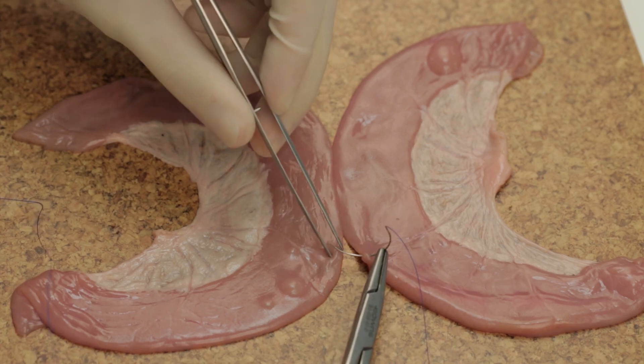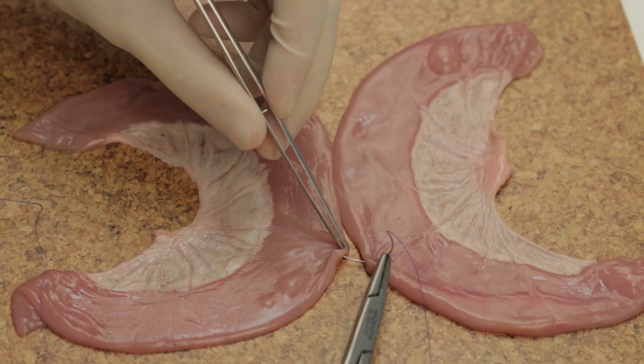In this video I will demonstrate the technique of hand-sewn two-layered side-to-side bowel anastomosis.